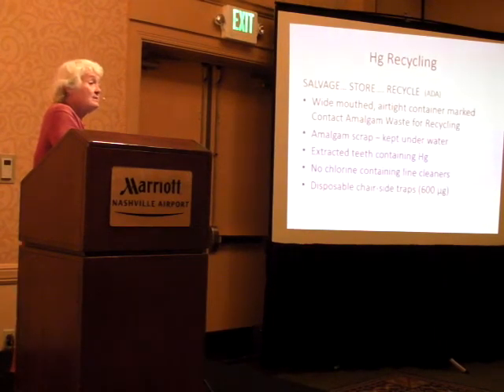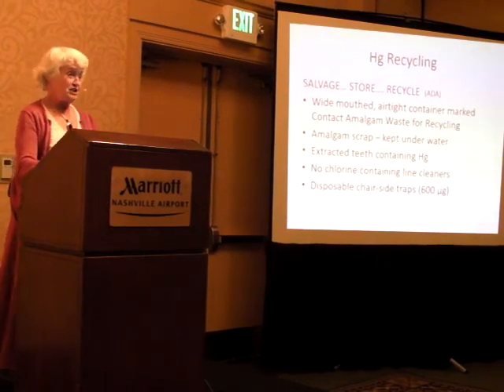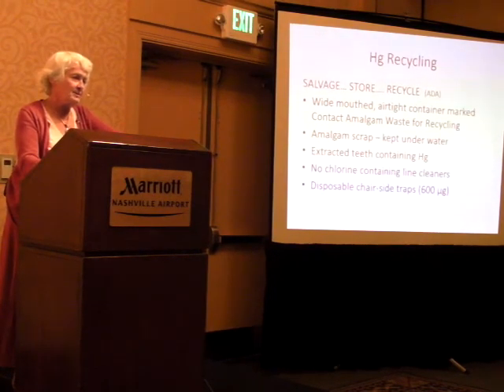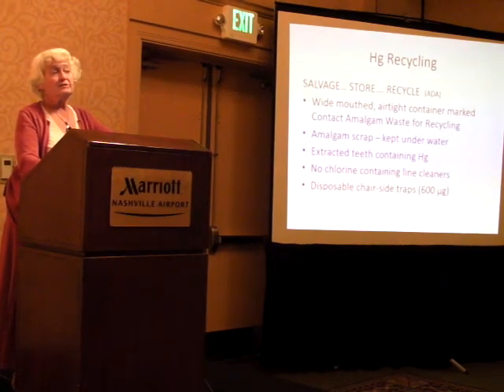The filters on the amalgam separators, with the TACT, it's once every 6 months, which sometimes is kind of strange because if you're not placing mercury, there's not a lot in there. But there's also an issue when you install these units, if they're hooked up to hygiene suctions. Hygiene tends to suction out a lot of toothpaste and pumice, and they really mess them up. So you couldn't really get away for longer than 6 months. If you do find that they are filled, then you need to do it more frequently. But there is a guideline there.